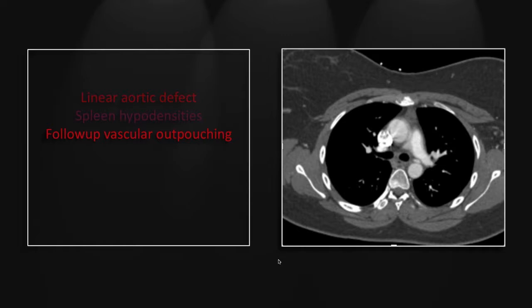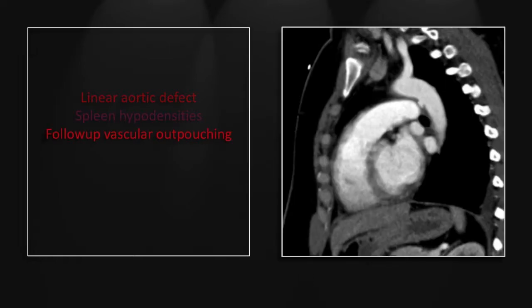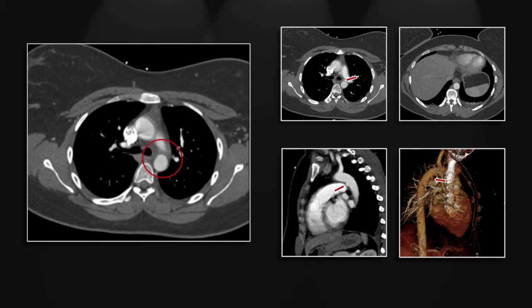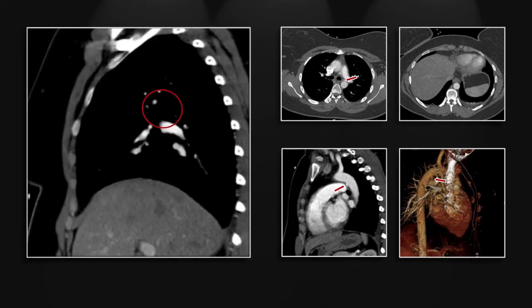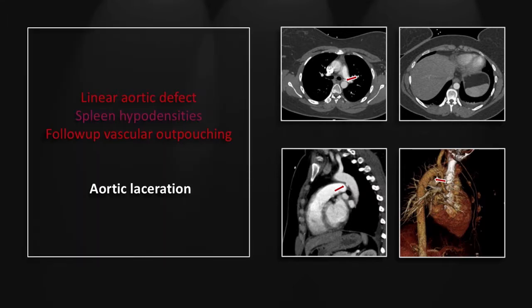This patient was scanned a week later and you can see a much smoother, most likely intimalized pseudoaneurysm, resolution of the splenic hypodensities, and again the pseudoaneurysm on the sagittal and 3D. And there it is on axial images and sagittal. So that is an aortic laceration at the aortic isthmus with later intimalization.